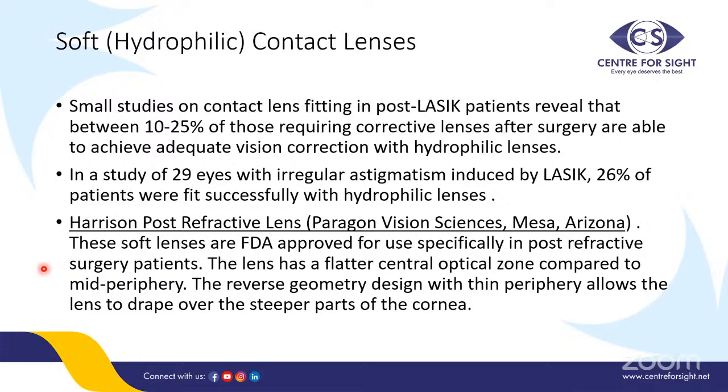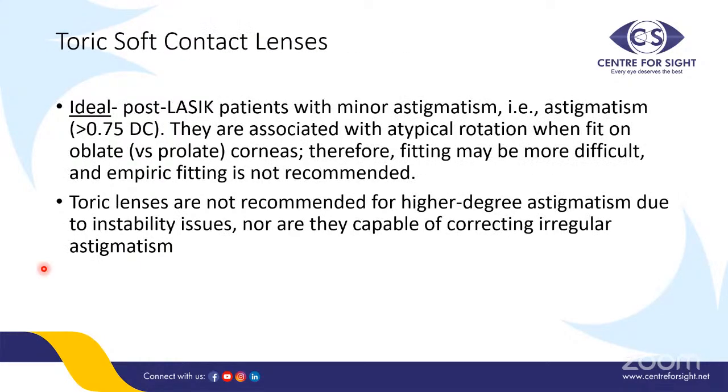I would just like to mention here that there is a Harrison post-refractive surgery lens, which is a soft lens approved by the FDA to be specifically used post-refractive surgery. This lens offers a central flatter optical zone as compared to the mid-periphery. It has a reverse geometry design that allows the lens to drape over the steep parts of the cornea. I will be dwelling into reverse geometry design lenses in the next few slides.